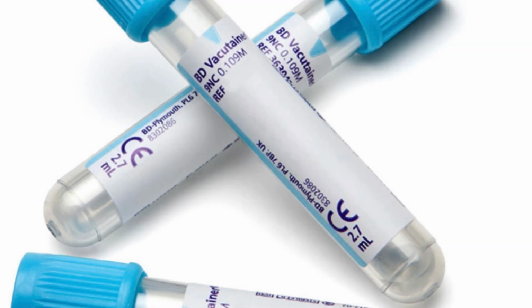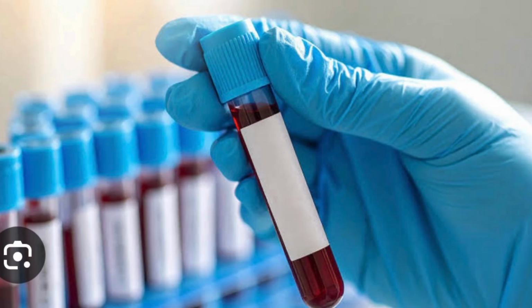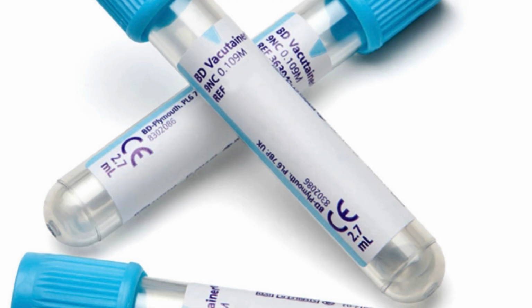As I was saying, for the light blue top tube, we invert the tube 3 to 4 times to mix the sodium citrate for accurate clotting tests. So in order to get an accurate test, we have to invert the tube correctly, 3 to 4 times, to get accurate test results.